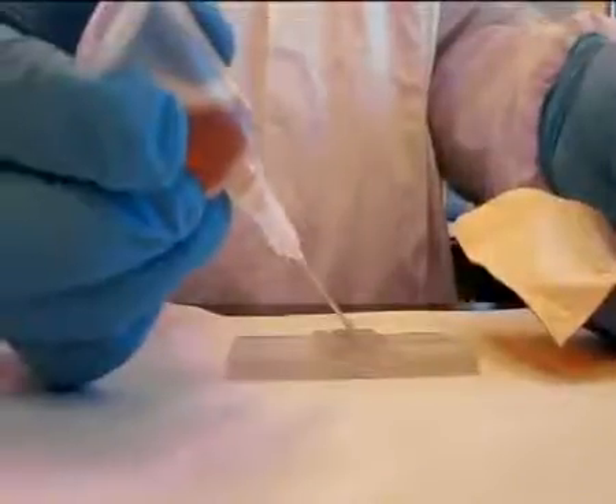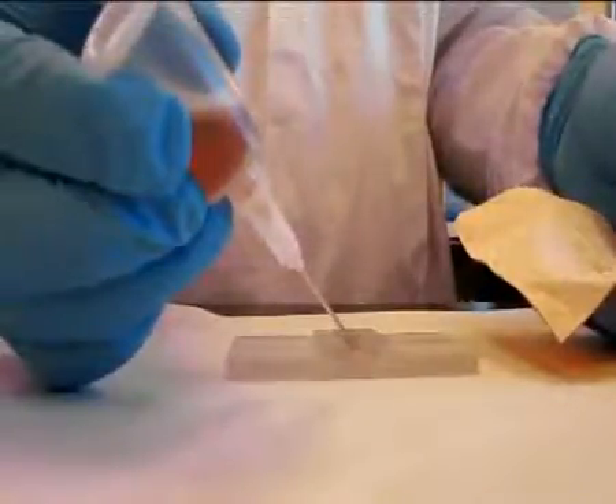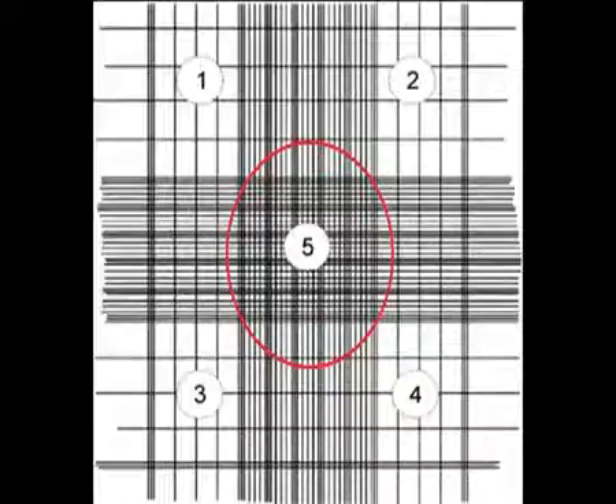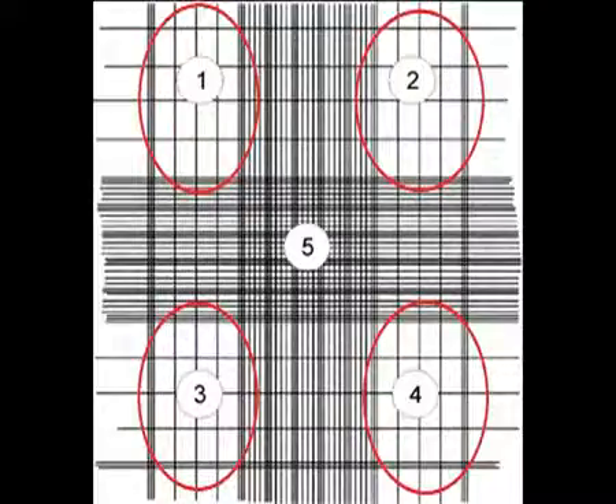After the 10 minutes have passed, expel a few drops of diluted sample through the pipette. Charge the hemocytometer, being careful not to over or under fill the chamber. Place the charged hemocytometer into the humidity chamber and allow to stand 10 minutes. You are now ready to count the platelets and the white blood cells under the microscope.